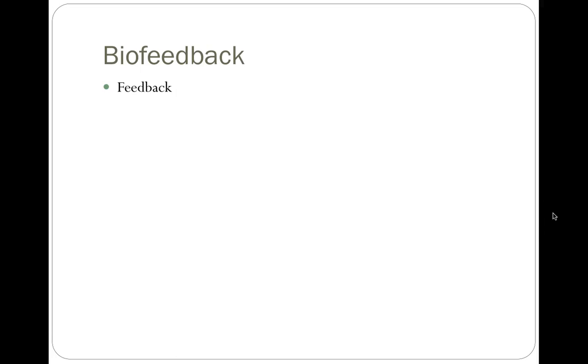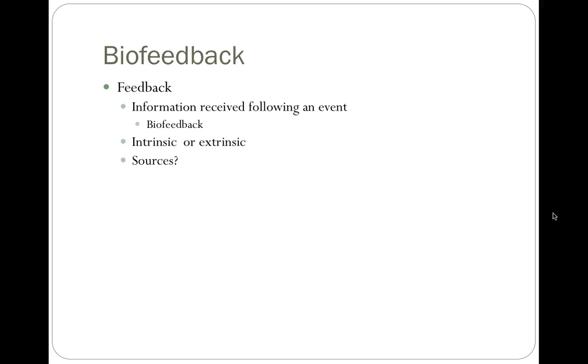When we break down biofeedback, we're talking about giving feedback, information that the patient receives after or based on emotion or an activity that he or she has performed. So it's essentially information received following an event, and again, with biofeedback relating specifically to some sort of biological function. It can be intrinsic, meaning something that they get from within their body themselves, or extrinsic, meaning that they receive the feedback externally.